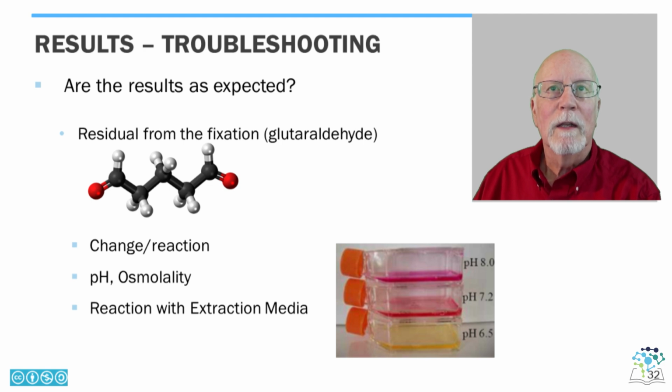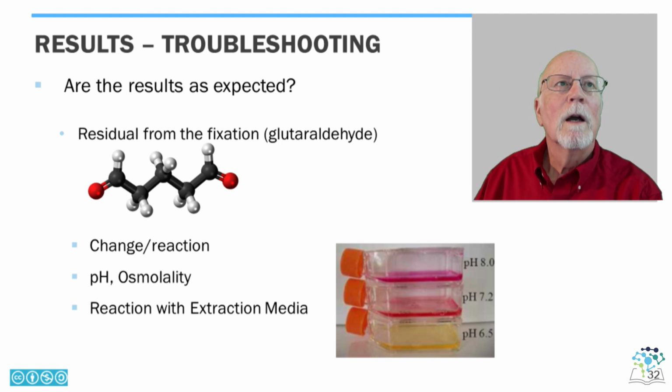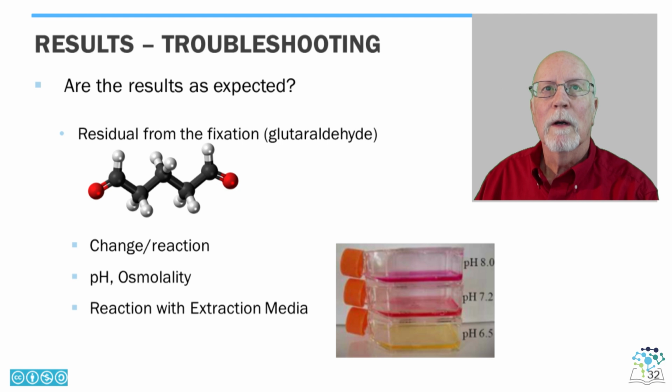Many devices, as in the examples we reviewed earlier, are composed of many separate parts, and the testing may only use selected components for a specified test. The correct components must be selected as the guidance we reviewed earlier stipulates.